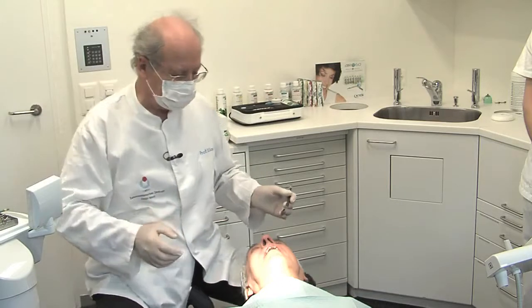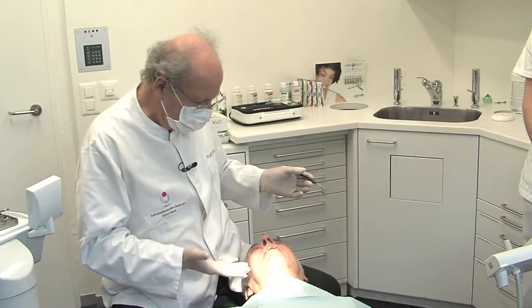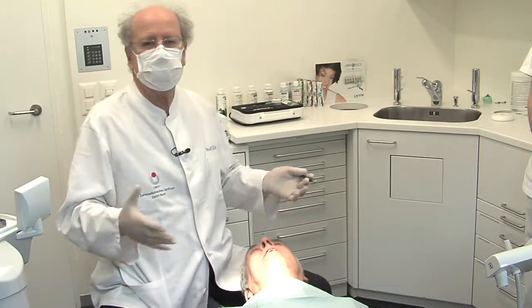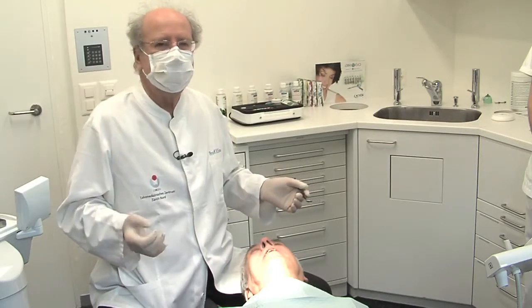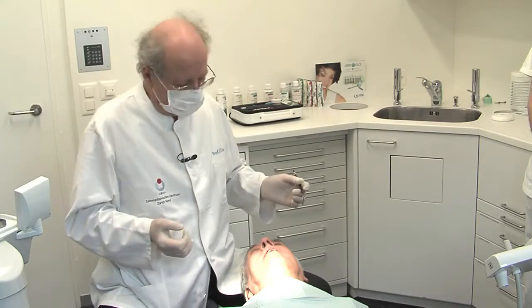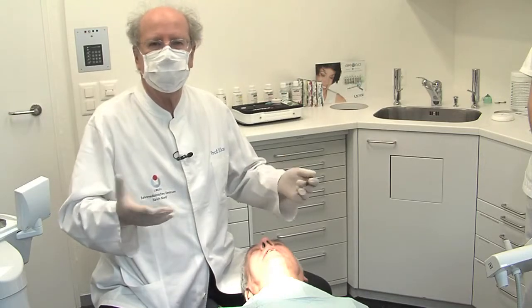I like this situation, and also when the patient cleans with his sonic toothbrush he will get good results. Do you feel pain? The patient tells me that he feels no pain, he feels quite comfortable. The only problem is that he feels that water and powder is in his mouth.